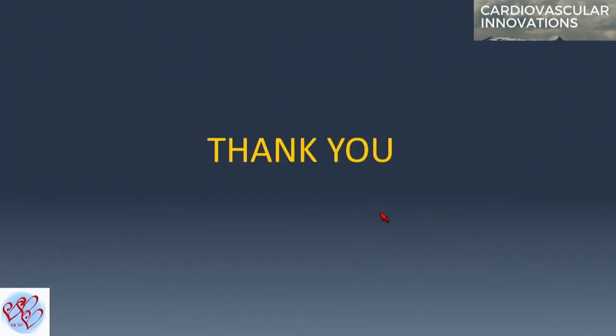The bottom line is you have a lot of devices, and I believe you have to have one or two devices in your lab for both intraluminal and subintimal crossing, to master pretty much these devices rather than try to master all of them at the same time.